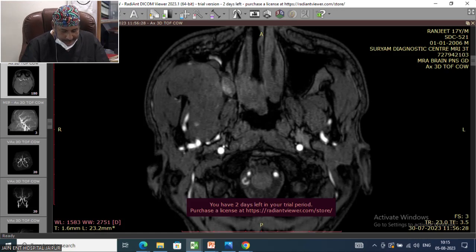See, it all depends upon the pathology you are looking at. Like in this case, clinically, you're suspecting a JNA. You have to order T1 weighted multiplanar imaging: axial, coronal, sagittal. Every imaging is shot separately in an MRI, not like a CT scan, where you can reconstruct in any plane. T2 weighted in all planes, T2 weighted fat suppressed in all planes. Angiogram, a CT angiogram if possible, is many times much better than an MR angiogram.